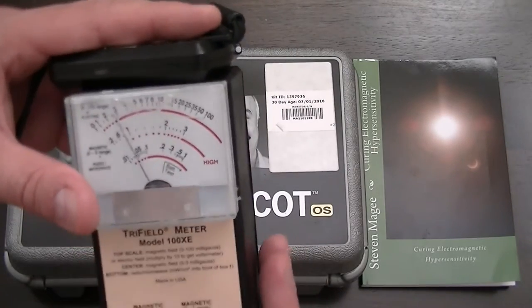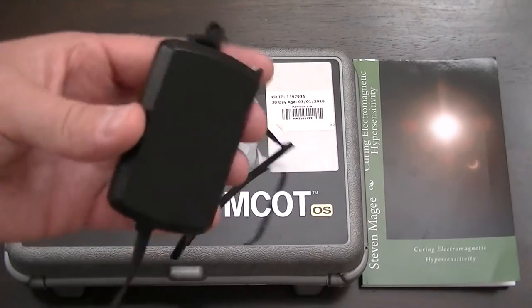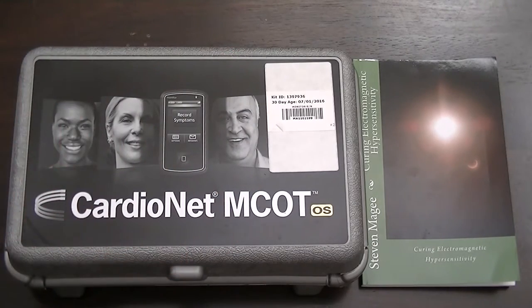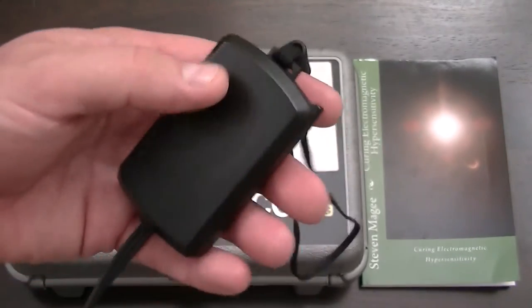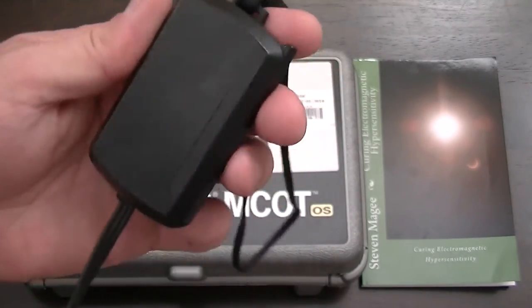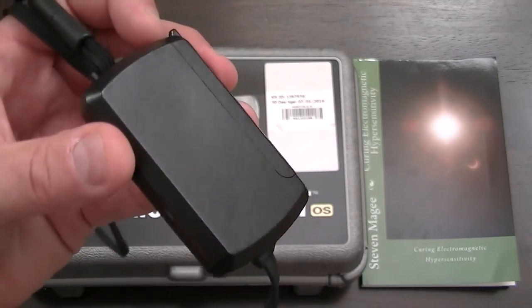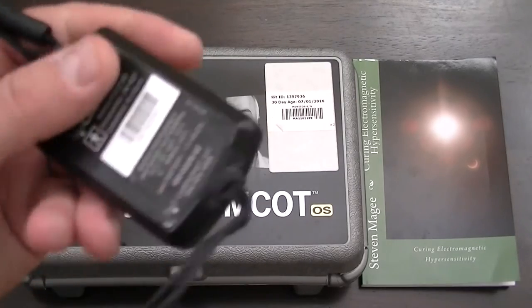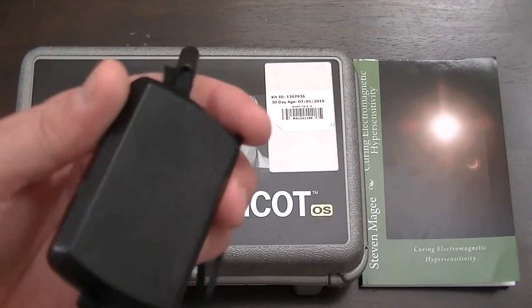I'm curious to know if you've been wearing one of these CardioNet MCOT devices — have you had any adverse effects from it? I did see a symptom I associate with radiation sickness: a shifting of radiation exposures, which is a one-off diarrhea reaction that only lasts about a day. That was the only real symptom I noticed. I've been wearing this for over three weeks, and there is certainly no evidence of hypersensitivity being triggered by this device. I'm very comfortable wearing it.